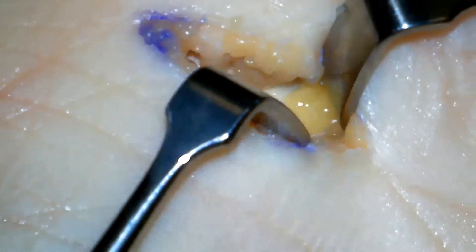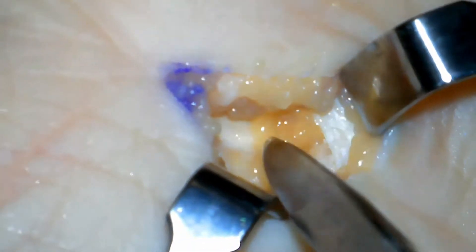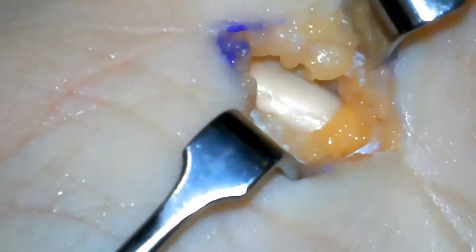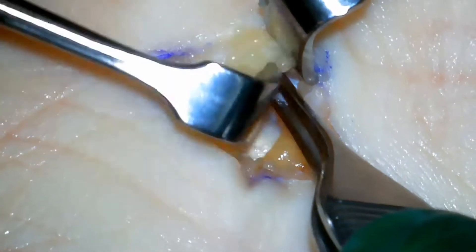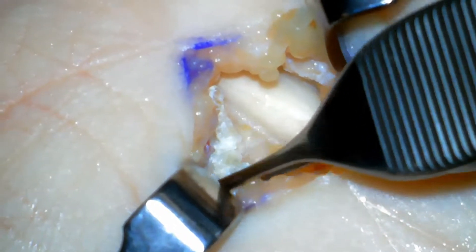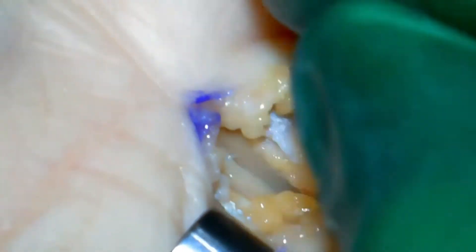One final check is performed at the end of the ligament to ensure there are no bands. This fatty tissue holds that main artery of the hand and we can see there is nothing constrictive. This right here is that thick transverse carpal ligament that was compressing the nerve and causing carpal tunnel syndrome. Now it is free and open.